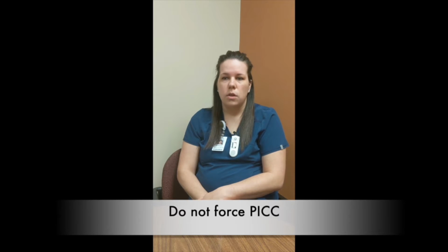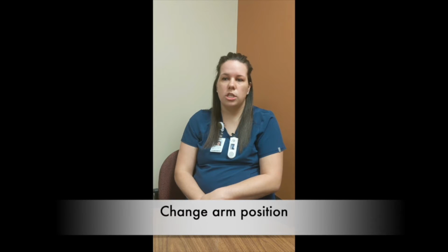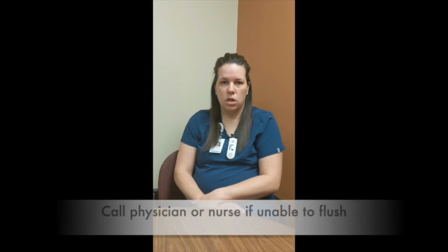If you are unable to flush your PICC, do not force it. This could cause the line to rupture if you push too hard. Try to change the position of your arm. Check for kinks or a closed clamp if your line has one. If you're still unable to flush, call your physician or their nurse.